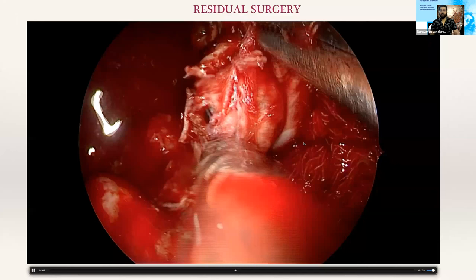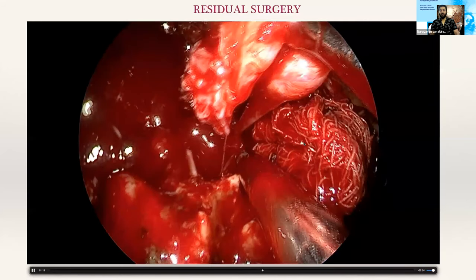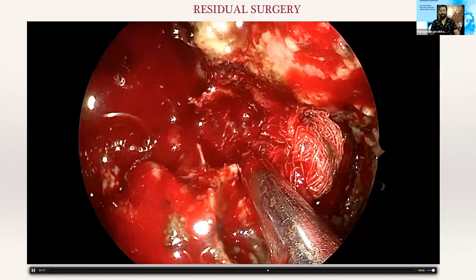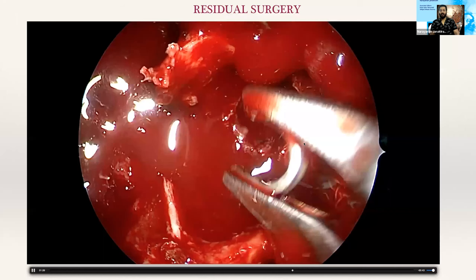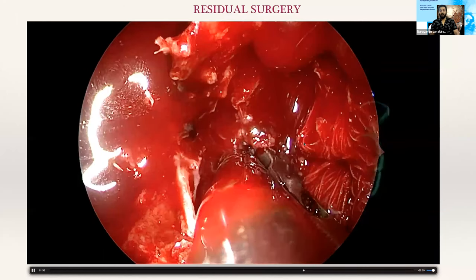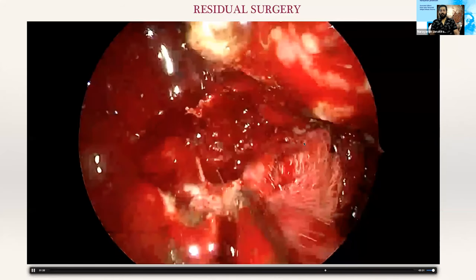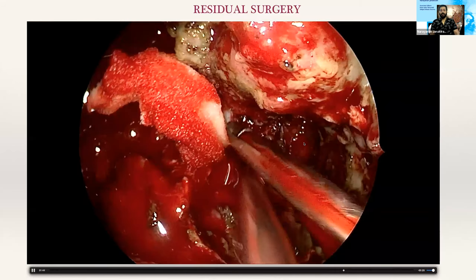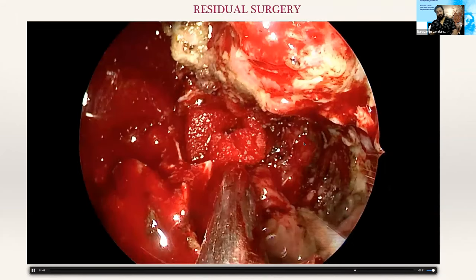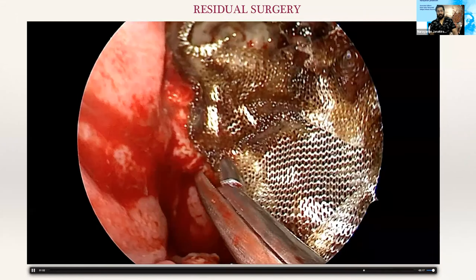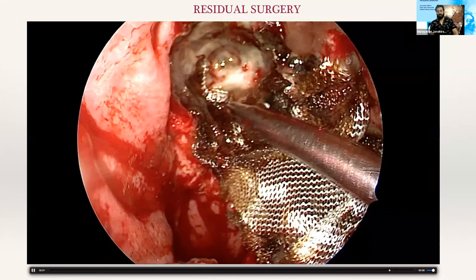I released the lateral pterygoid plate and the tumor came out beautifully. It was not seen in the first surgery because I didn't search for it — I agree. The ascending pharyngeal vessel is beautifully seen. I put the clip over the ascending pharyngeal artery coming from below upward. That's it. I'm packing with gelfoam. Imagine if I had left it behind wantonly — but if the patient had not consented for a high-risk approach, I would not venture into dangerous territory. You can see the orbit above and the tumor has been completely removed.